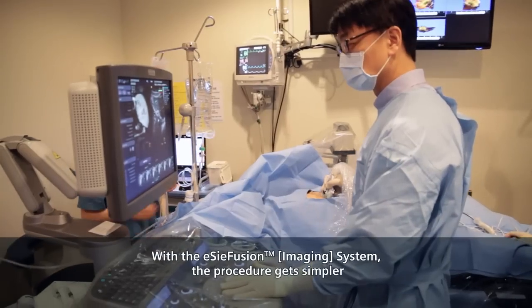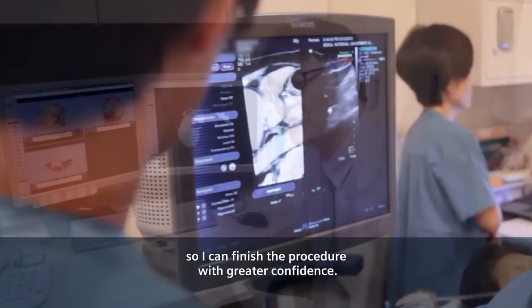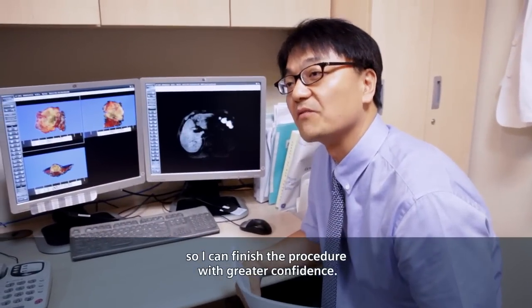With the Easy Fusion system, the procedure gets simpler so I can finish the procedure with greater confidence.